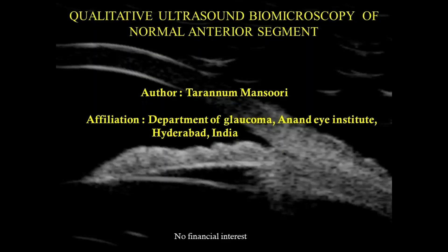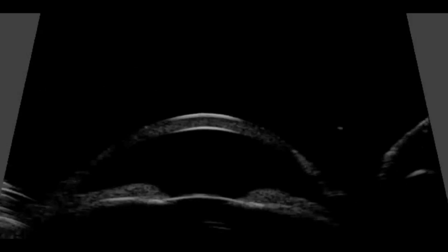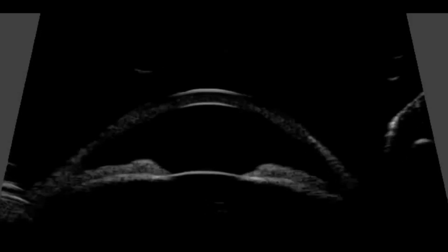Qualitative Ultrasound Biomicroscopy of the Normal Anterior Segment. UBM is a high-resolution ultrasound technique which allows non-invasive in vivo imaging of the ocular anterior segment structures. Before interpreting the UBM images of diseased eyes, it is essential to understand the structures seen in the imaging of the normal eye.